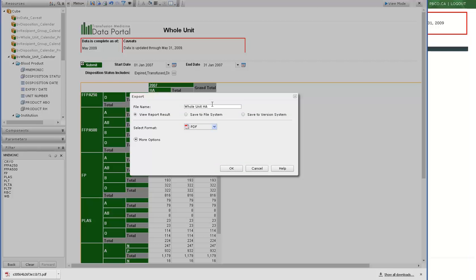and I name my file. Here I will want to be really careful how I name this. I'm going to want to be really clear what I did and what I'm looking at. Because what is going to export is this panel here. You will see the logo and the cube, so you'll know where that came from.